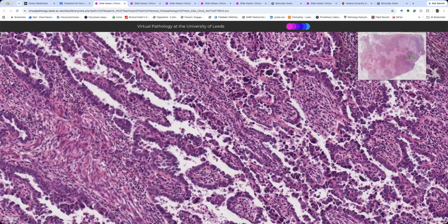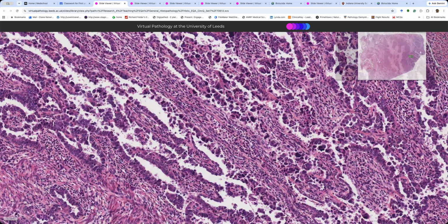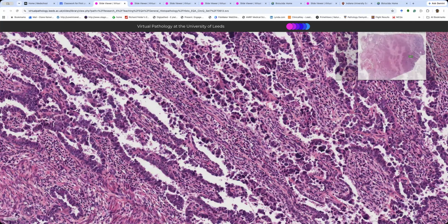Much, much more elongated. And the cells are kind of square rather than cigar shaped. One of the big clues for serous is that the amount of atypia in the cells is out of keeping with the amount of glands formed.